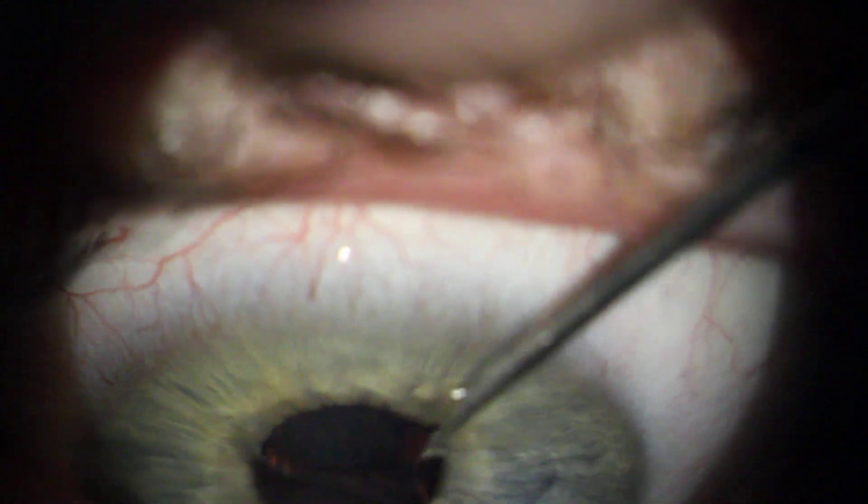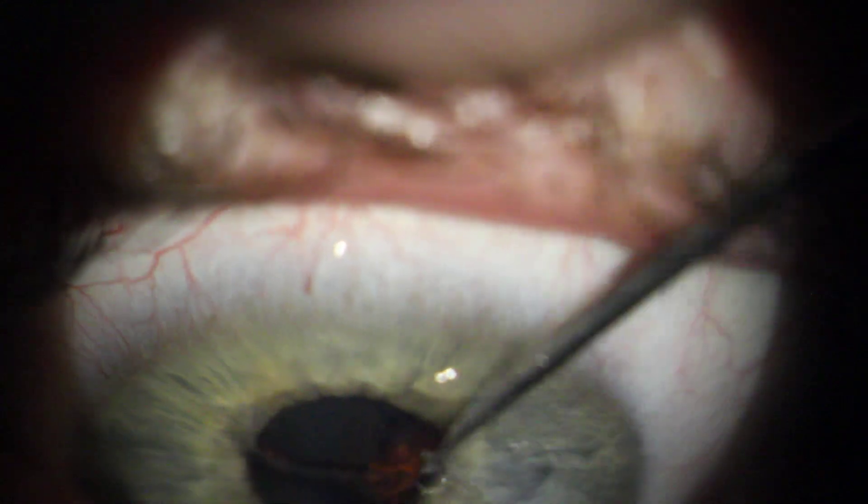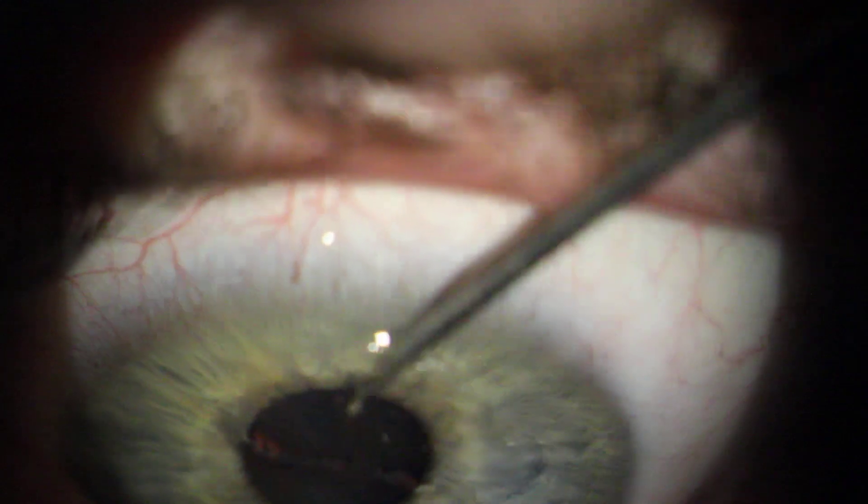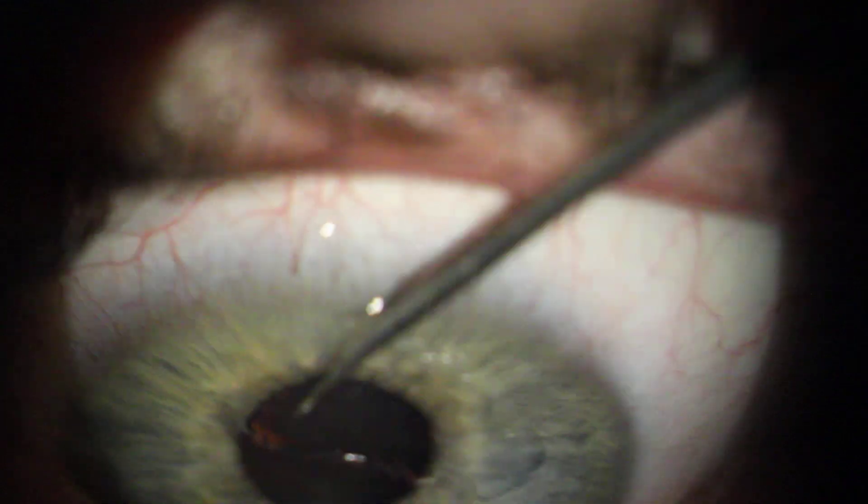So everything is off that needed and then I'm just going to give it a couple of like a little back and forth rub so that as it's regrowing it has some... I can feel the under tissue just a little bit easier.